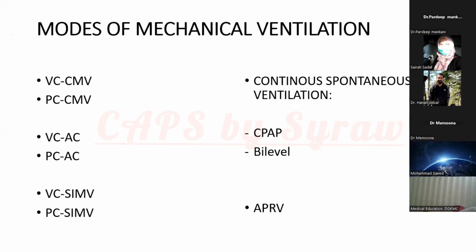So, if a patient has bronchospasm or any airway restrictive lung disease, yes, pressure control has its advantages, but you see, if a patient has a problem of compliance, this is a very good mode to use in those patients. Patients who are overly compliant, like COPD and emphysema, or patients that are having stiff lungs and low compliance, you could use it in both of these patients. So you take the advantage of both of these subsets of modes.